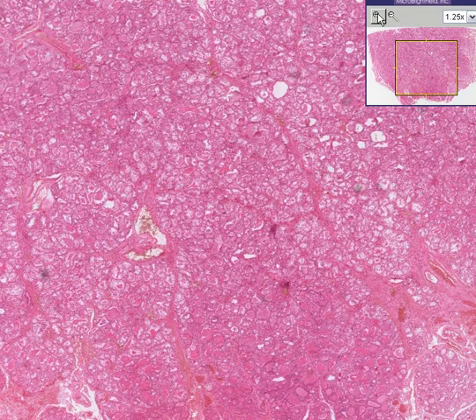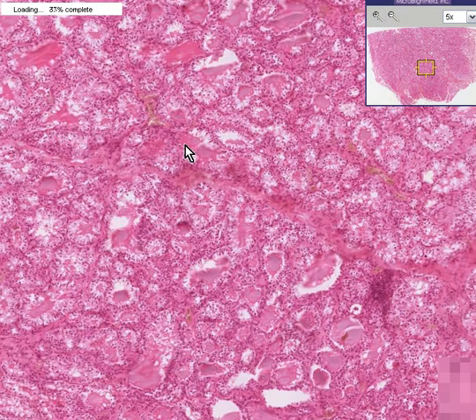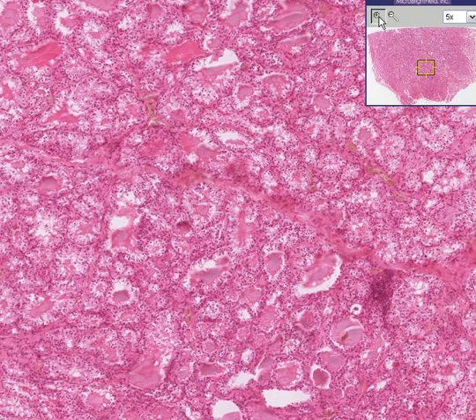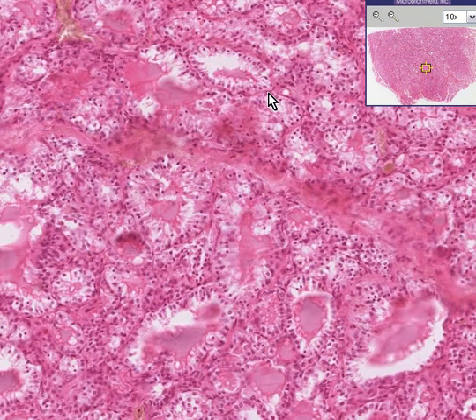It's not enlarged because the follicles are enlarged. In fact, up here you could see the follicles are very small. There is just a tiny amount of colloid in every follicle. This thyroid is enlarged with small follicles.